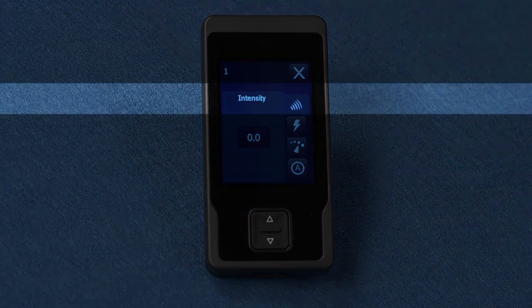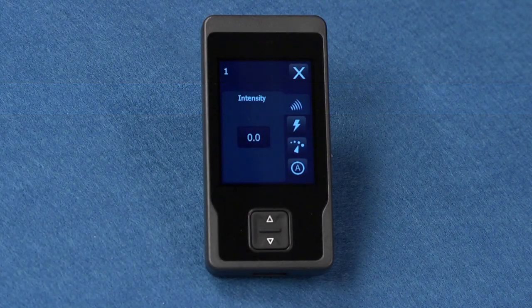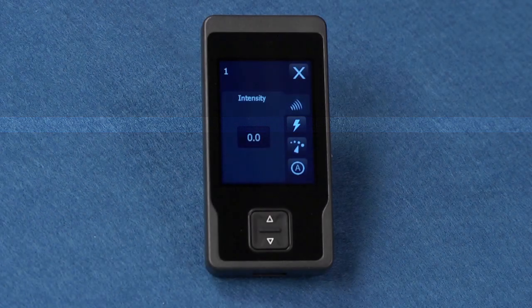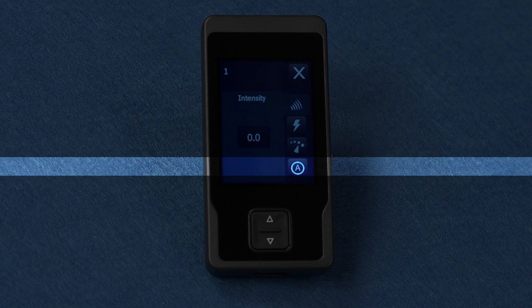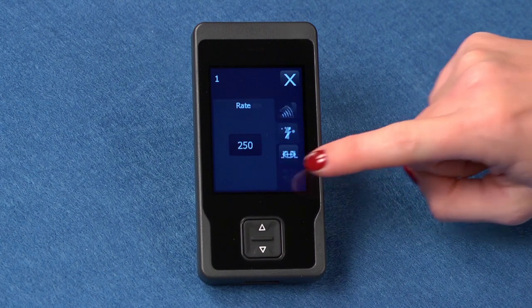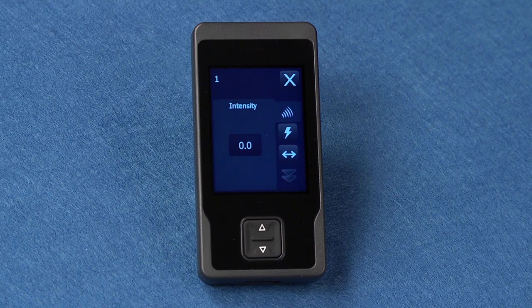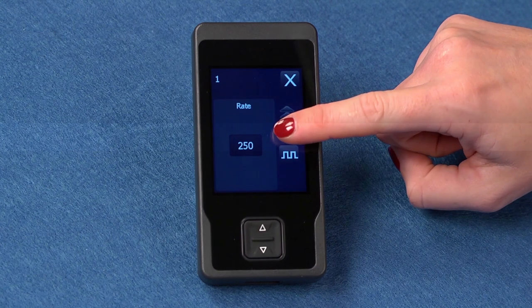This is the intensity icon. Intensity controls the strength of the stimulation. This is the stimulation icon. This turns your stimulation on or off. This is the adaptive stim icon. It turns adaptive stim on or off. These are the up-down buttons. You can press these to view additional stimulation settings for a program. The up-down buttons may or may not appear, depending on how your clinician has programmed your neurostimulator.